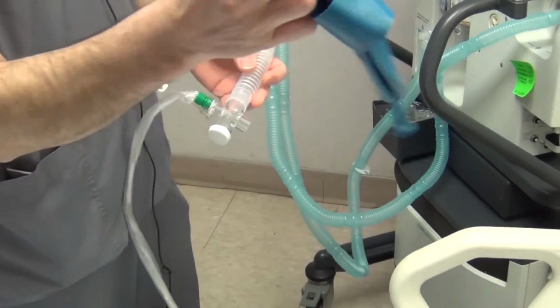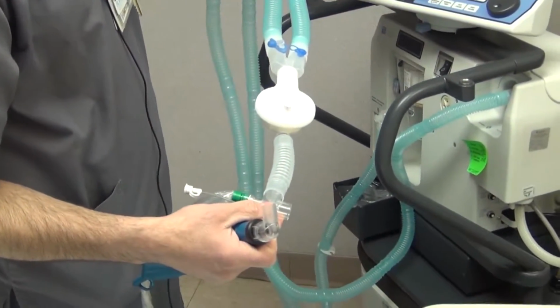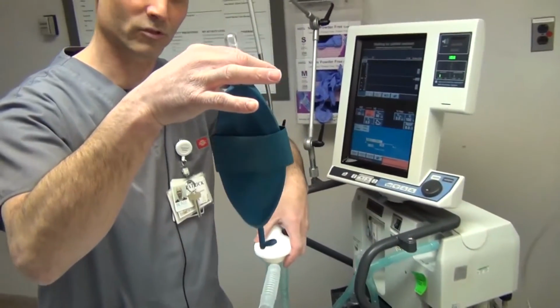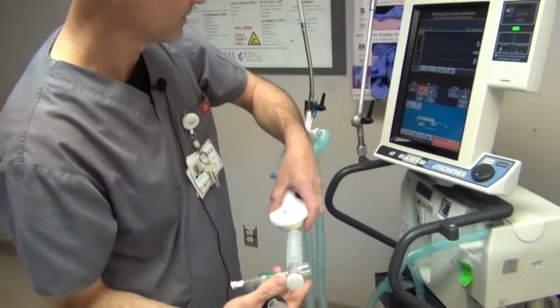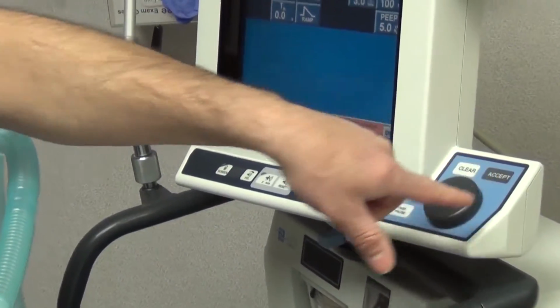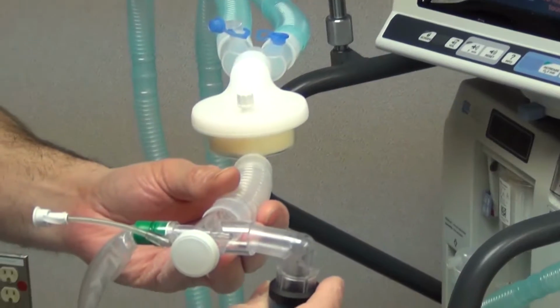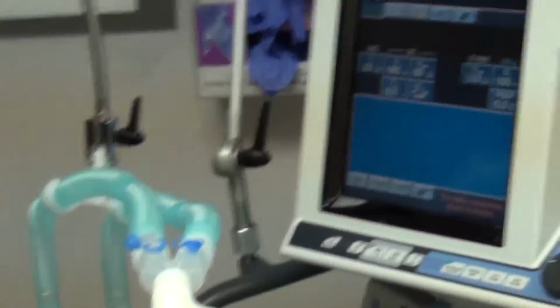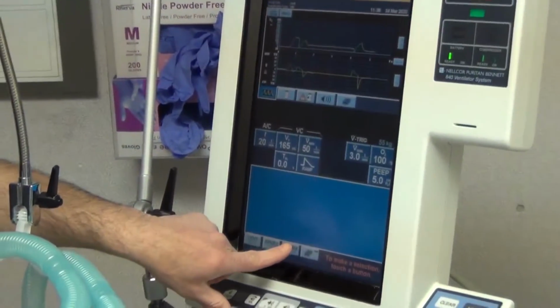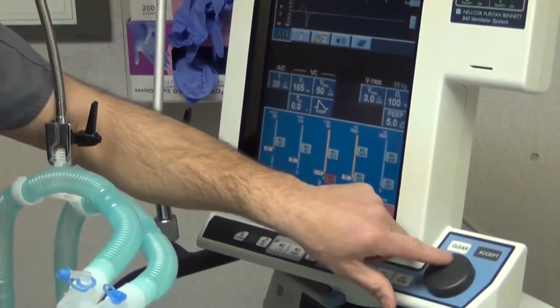For my purposes, I have this little test lung, which I'll show you here, but I'm going to reduce the tidal volume here because this is not a normal size lung for a human. So I'm just going to drop this volume down as low as I can. I'm going to hit accept. And as soon as you connect the patient, I want you to look at the screen. It goes immediately into ventilation. And we're going to get some alarms because this tidal volume, or minute ventilation, is going to be really low.